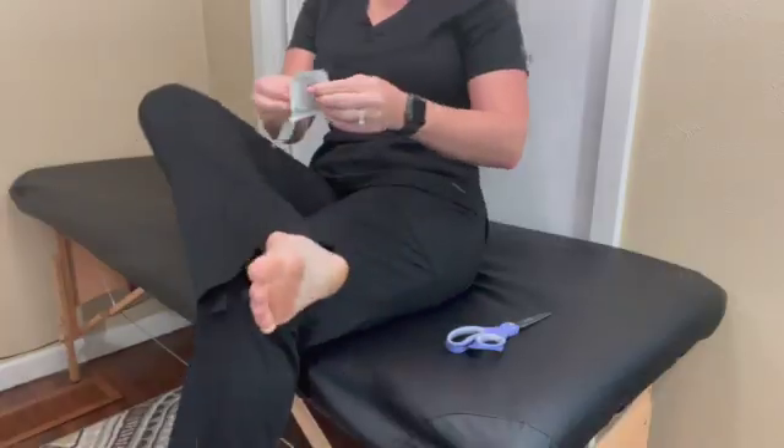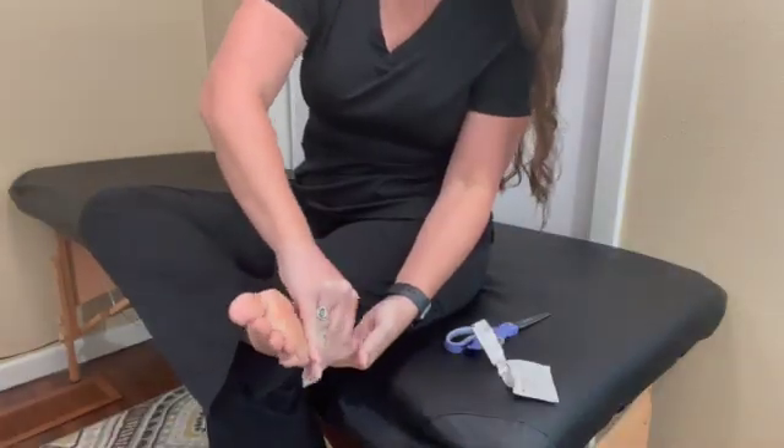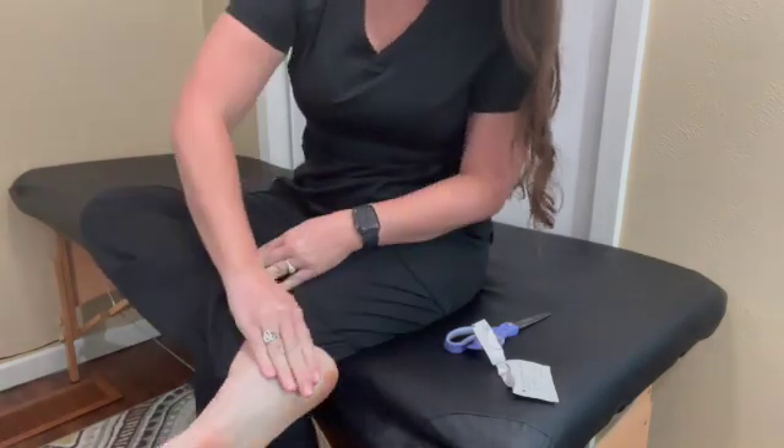Once you've ensured your patient understands the what, the why, and the how of K-Tape and you've received their consent, now you can think about applying K-Tape. The next step is to prepare the skin. K-Tape should be applied to skin that is clean, dry, and not excessively hairy. Grab an alcohol wipe and wipe the skin clean where you're going to apply the tape — this removes any natural oils, moisturizer, etc. that could interfere with adhesion. Wait for the area to dry before moving on.